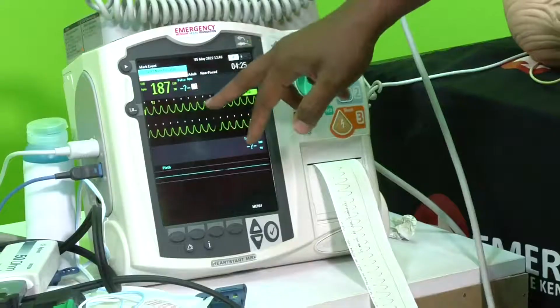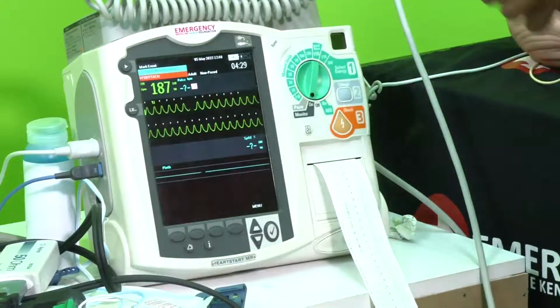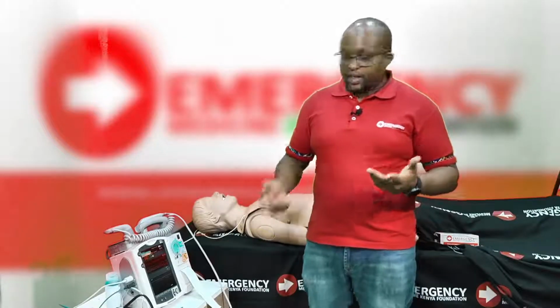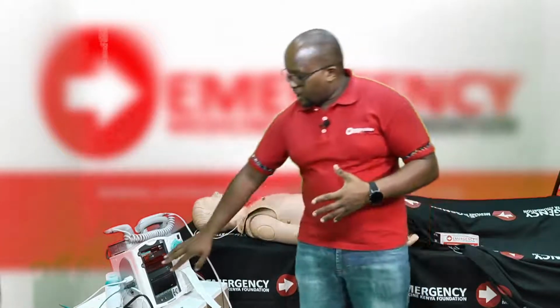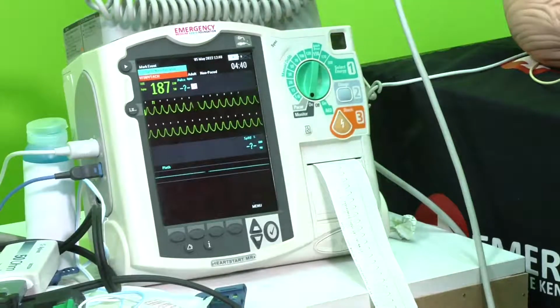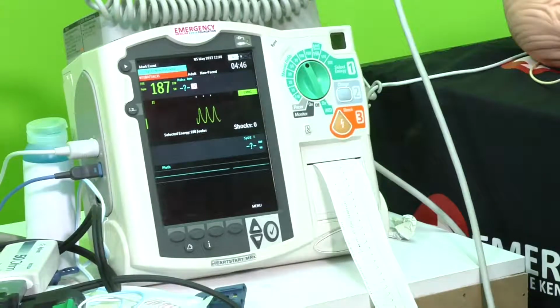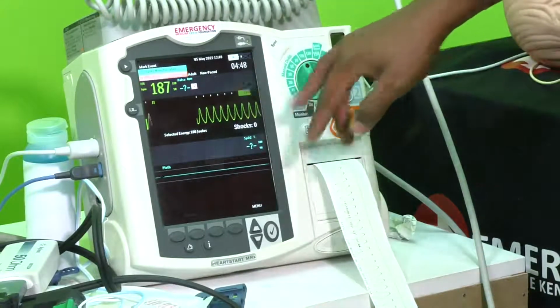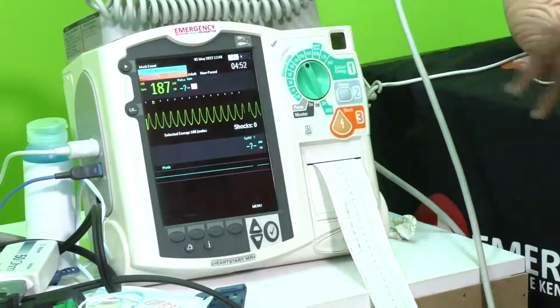that's S. M is for markers. I can see my markers, okay? Then the other part is select, S is select energy in joules. So in this particular patient, with this rhythm, which is a ventricular tachycardia, he has a pulse, compared to defibrillation. I've already given him some analgesia and some sedation. I'm going to start at 100 joules, okay? So sync, markers, select energy. I've selected energy at 100 joules.